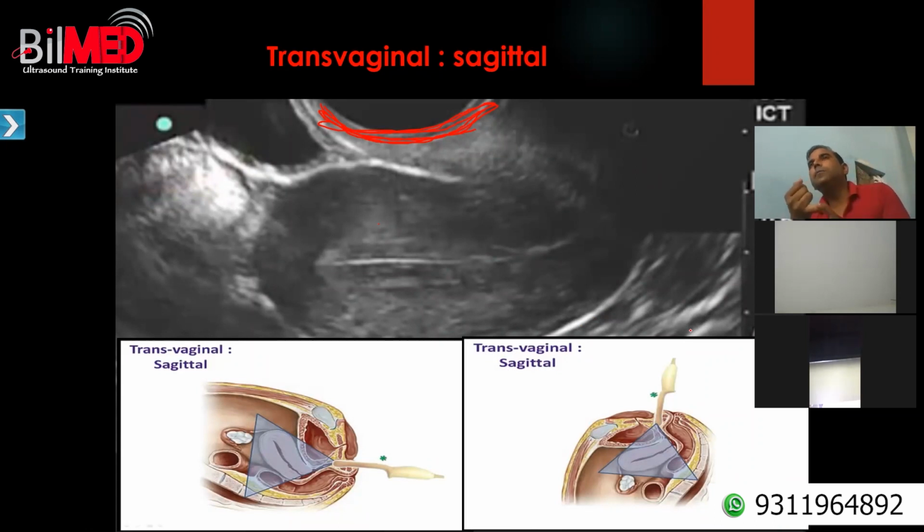What is the anterior? Anterior of patient. What is your name? Sir, Namita. Dr. Namita. You know where is anterior, where is posterior, where is right, where is left, where is superior, where is inferior on the image? Yes or no? Yes, sir.